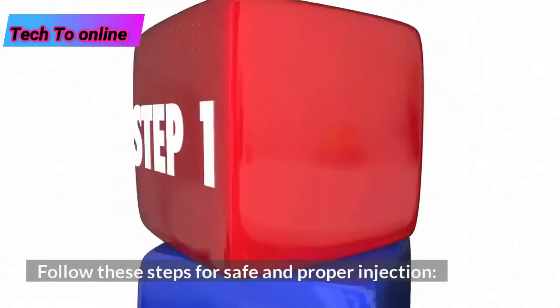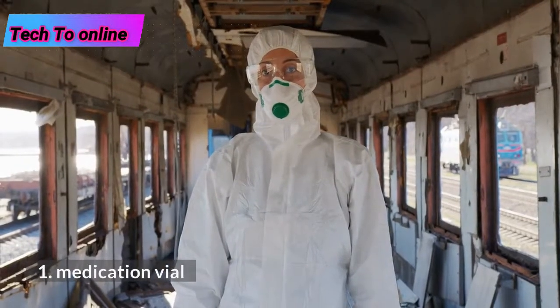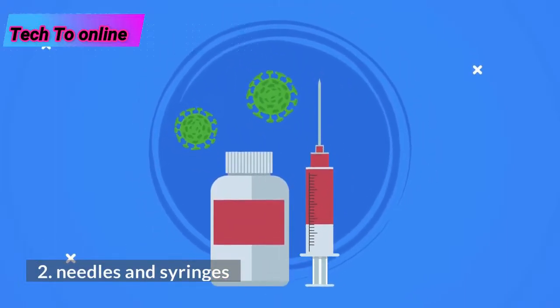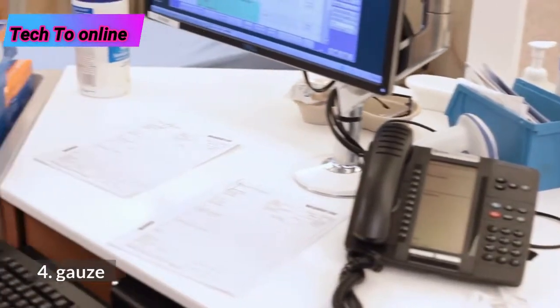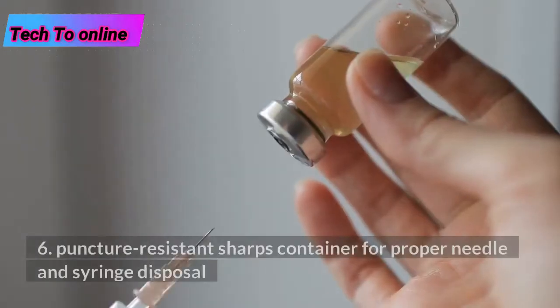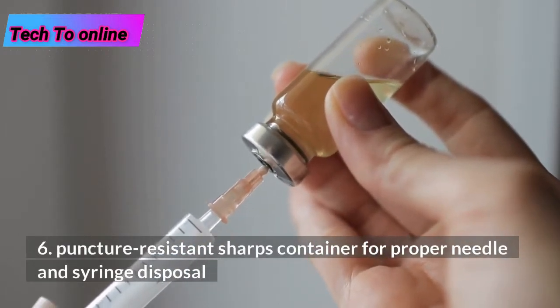Follow these steps for safe and proper injection. Step 1. Gather the supplies. 1. Medication vial. 2. Needles and syringes. 3. Alcohol pads. 4. Gauze. 5. Bandages. 6. Puncture-resistant sharps container for proper needle and syringe disposal.